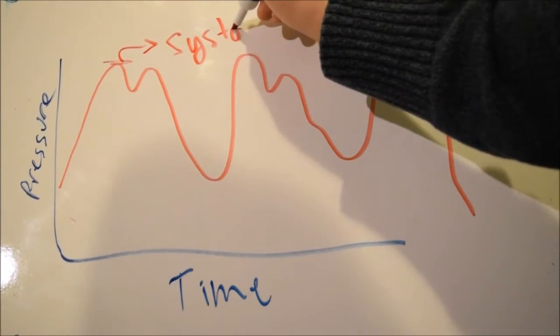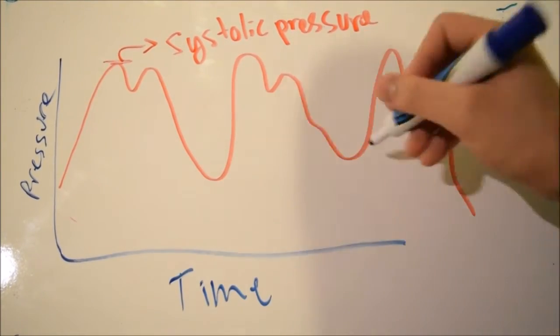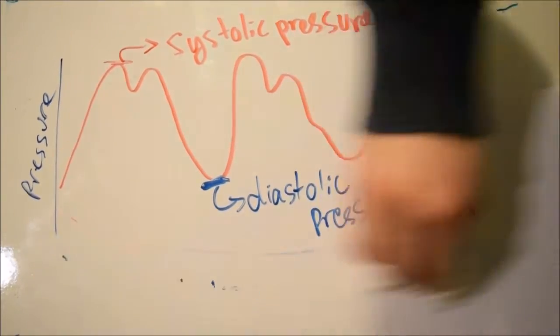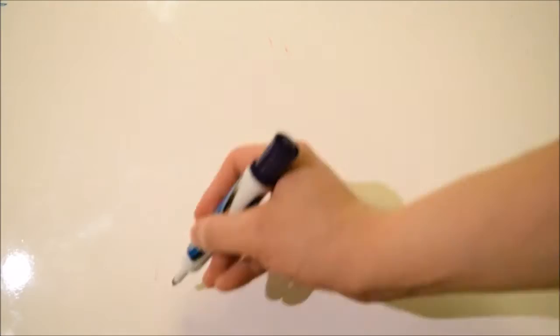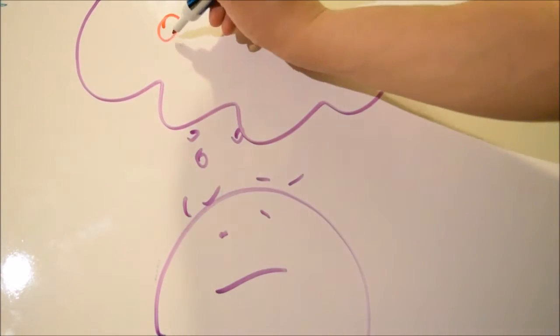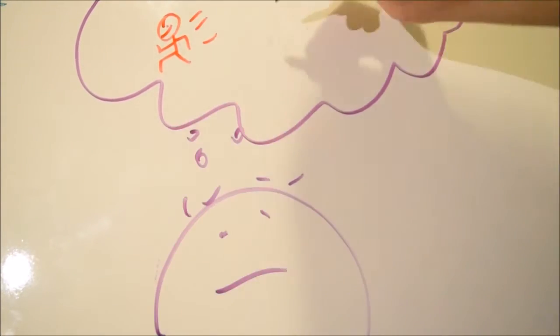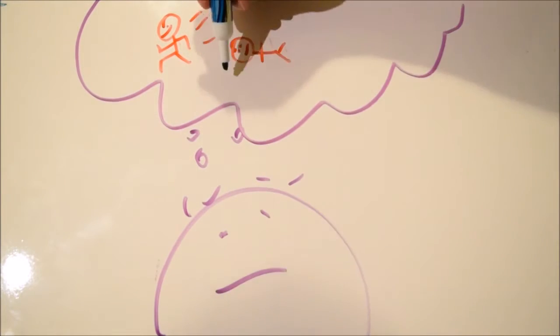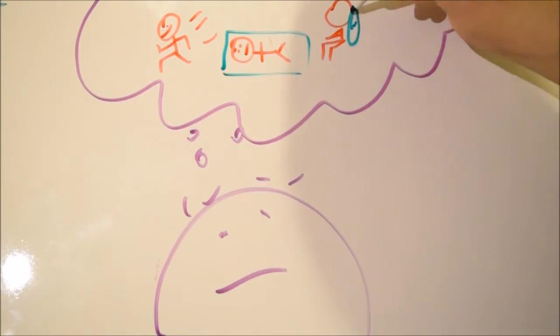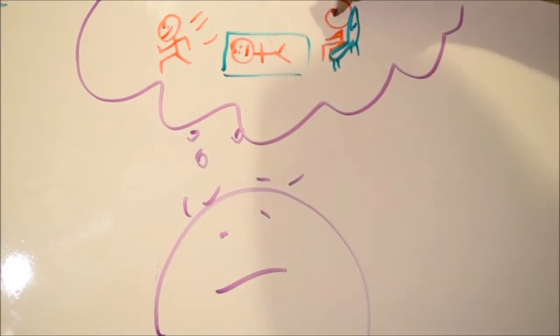Systolic pressure is the highest arterial pressure reached during ventricular systole, while diastolic pressure is the lowest arterial pressure reached during ventricular diastole. These 2 pressure values change depending on the state of the patient, or in this case, the subject. This may be running, standing, or sitting, etc. So it's important to keep the subject in a stable environment to decrease the discrepancy. Thus, we'll also complete each experiment twice, which will further help with that.